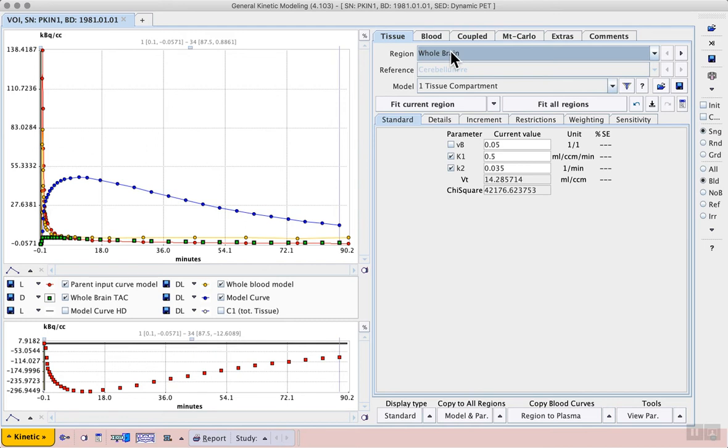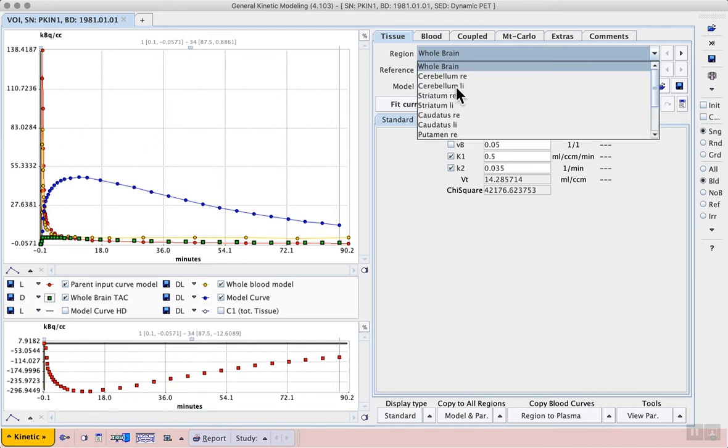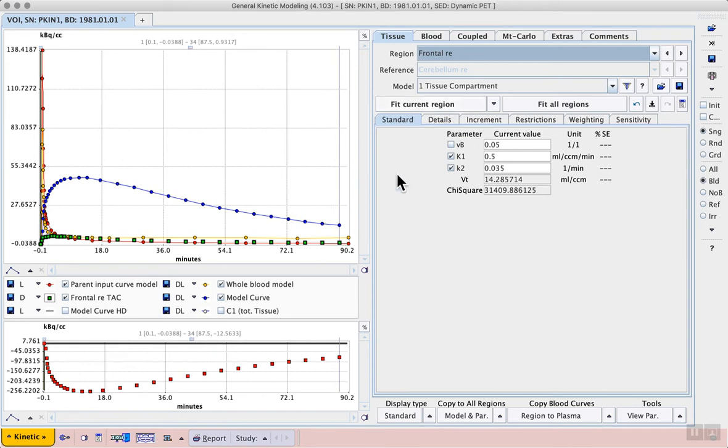So instead of using that we can select another large but more homogeneous region from the list of regions. In this case we can try the right frontal VOI.